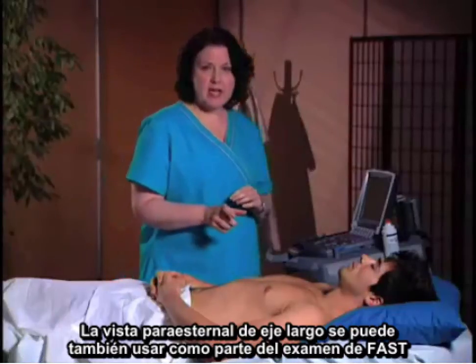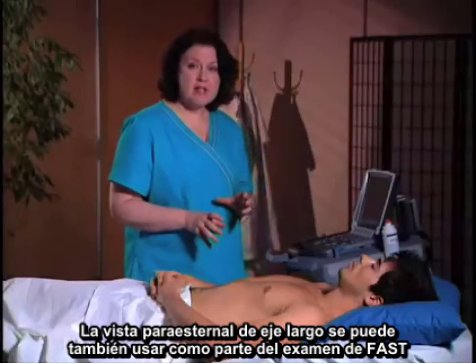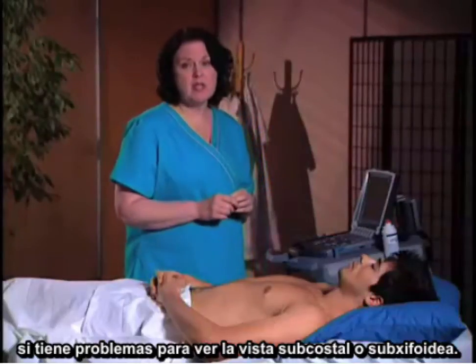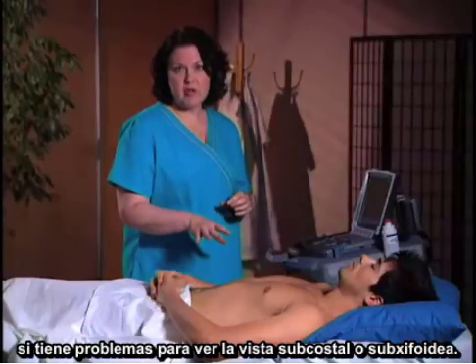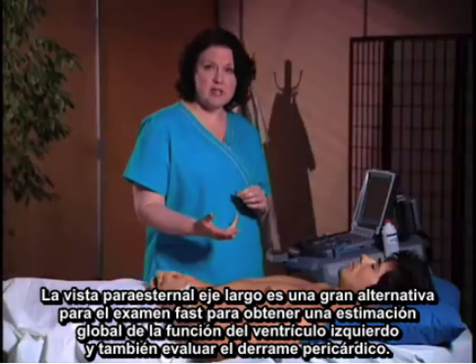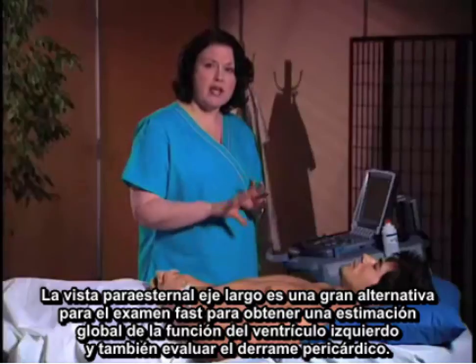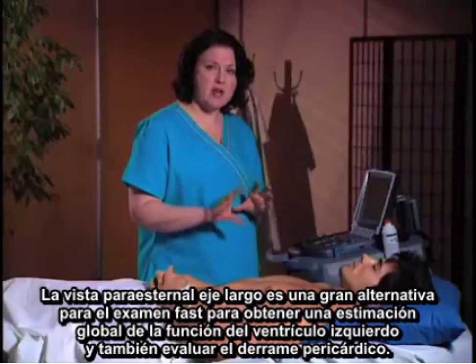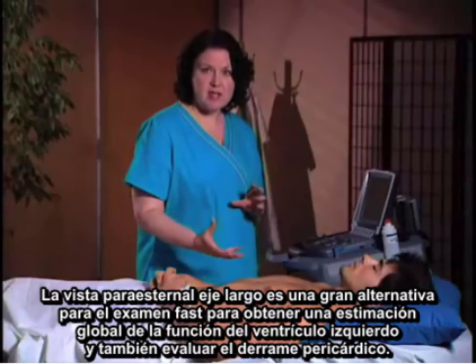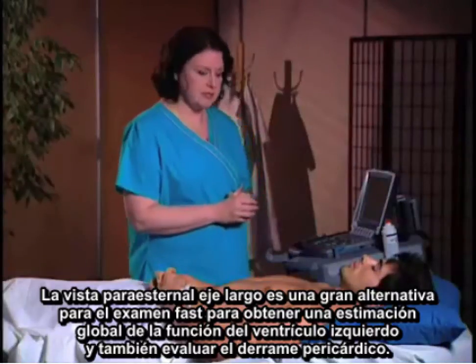The parasternal long axis can also be used as part of your FAST examination if you're having trouble doing the subcostal or subxiphoid view. It is a great alternative to get an overall estimation of function of the left ventricle as part of the FAST exam, and also to evaluate for pericardial effusion.